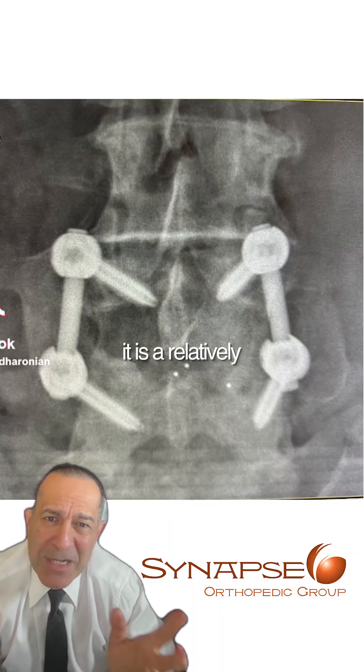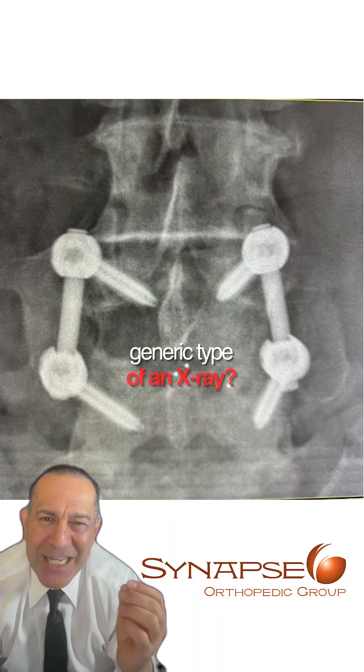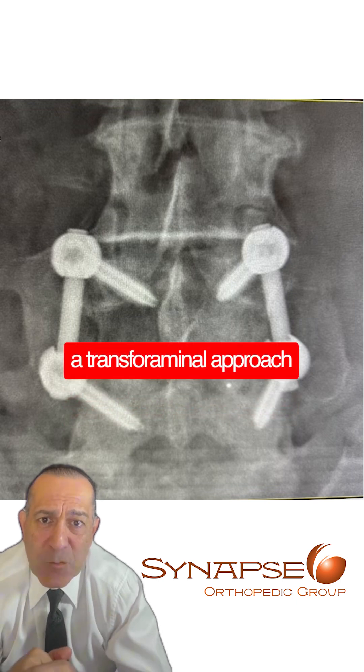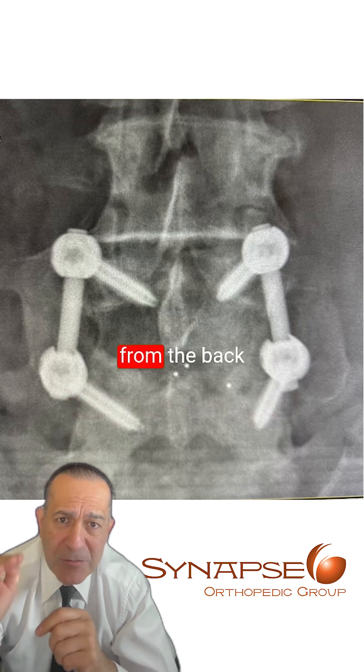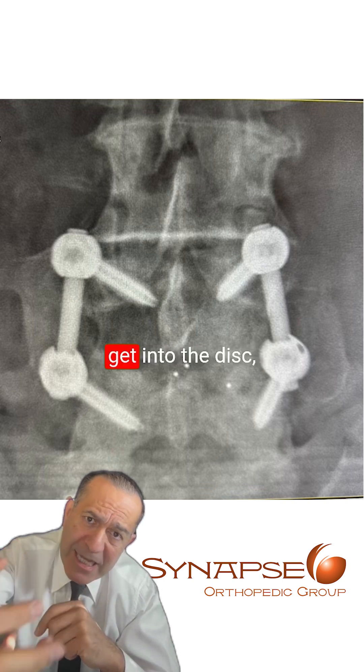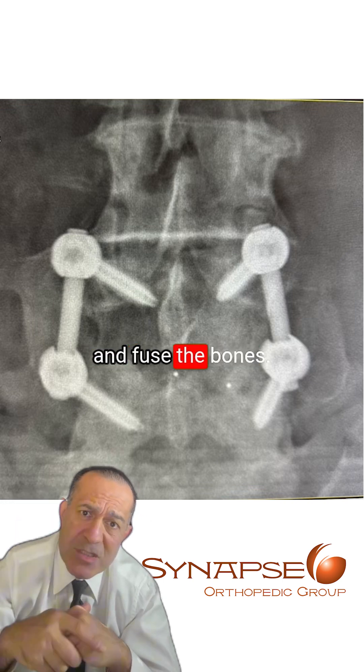What do you see on this x-ray? It is a relatively generic type of x-ray of a lumbar fusion. This was done through a transforaminal approach, which means we go from the back of the spine, approach the spine from the side, get into the disc, remove the disc, and fuse the bones.